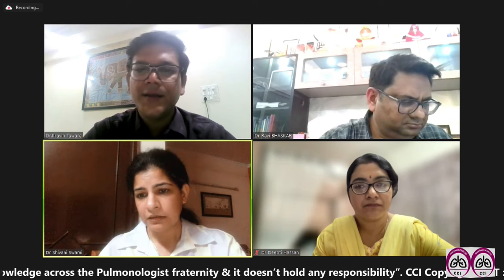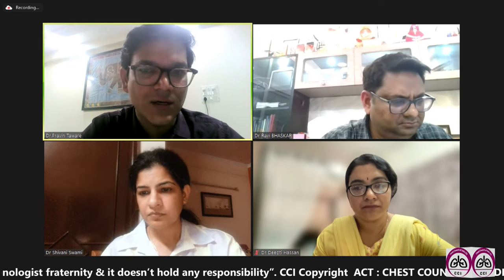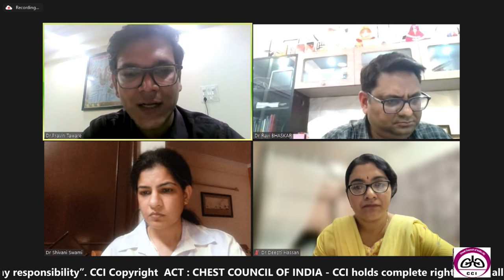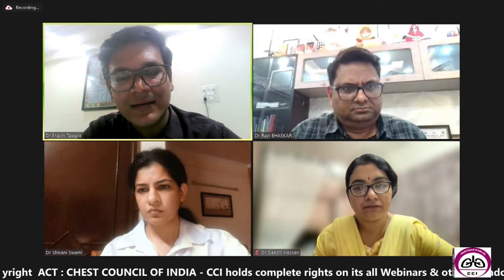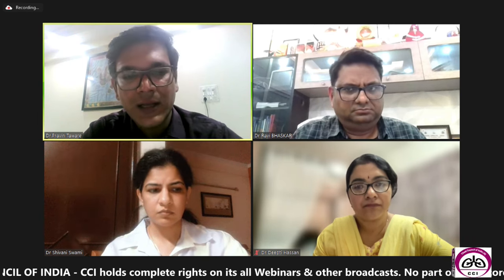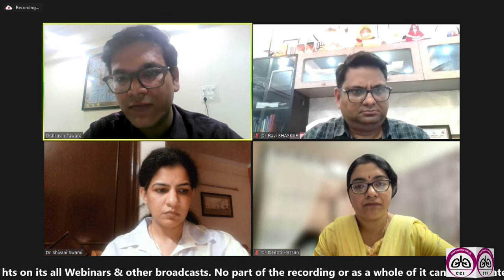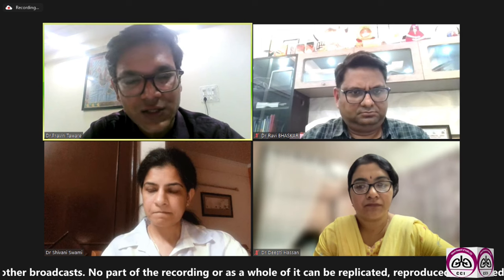Yeah. So it's a very important question, as all doctors and even paramedics should understand the mode of this nebulization therapy and what it can lead to if it is not given in infection isolation rooms. So it should preferably be done in airborne infection isolation rooms, if possible in negative pressure rooms, if the patient is infectious. And as I work in a big group of TB hospitals in Mumbai, we have a lot of sputum positive or sputum negative tuberculosis and post-TB patients who require nebulization round the clock.